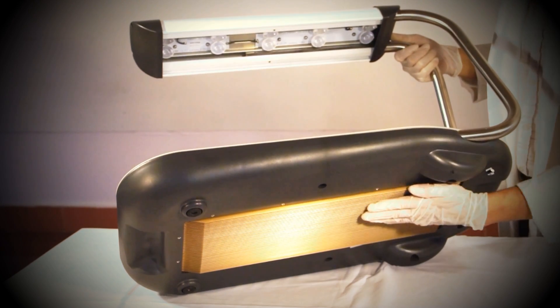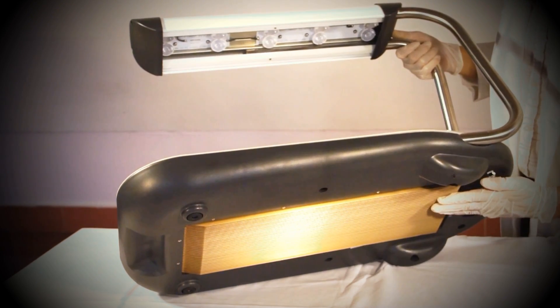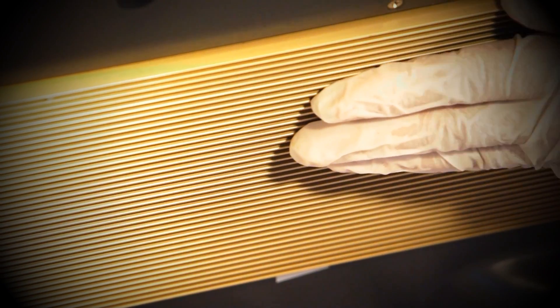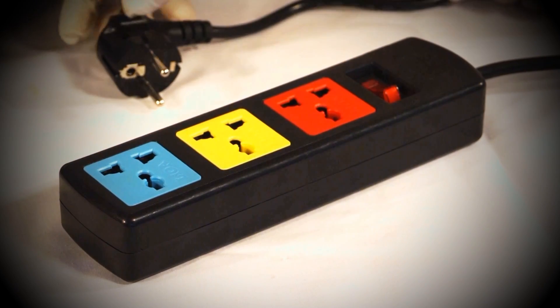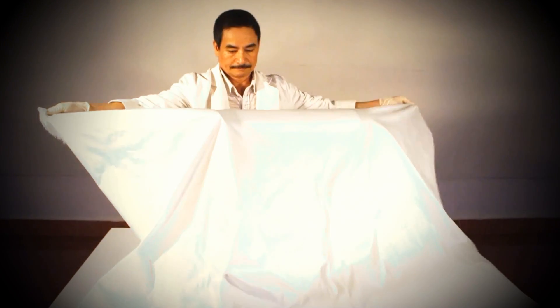Remember to always place the Firefly on a hard, flat surface so as to avoid overheating the machine. This is because the heat is released from the bottom of the unit. When the Firefly is not in use, it is important to keep it covered to avoid dust collection and accidental damage.